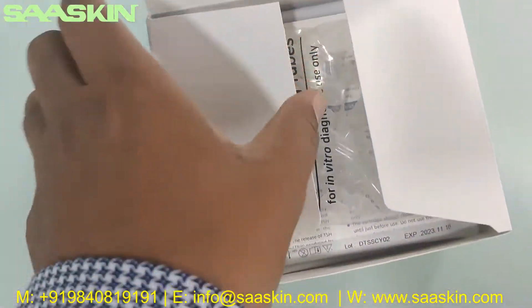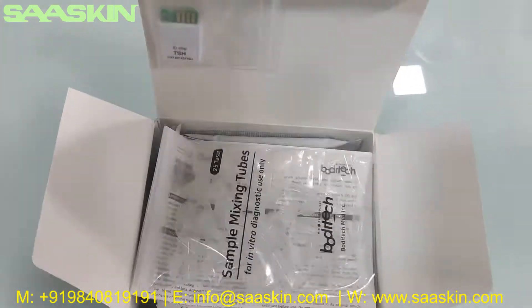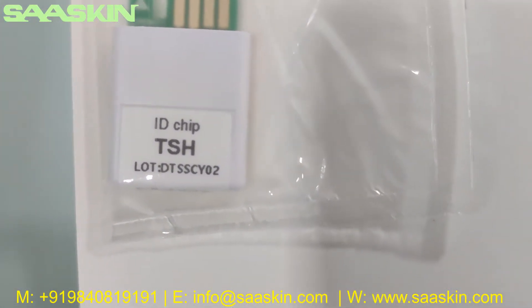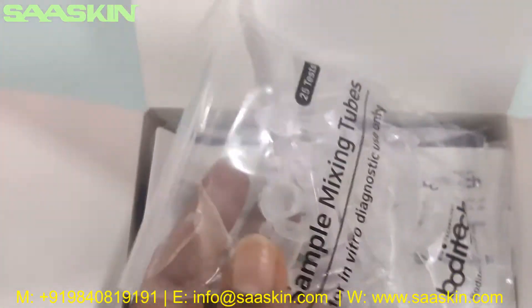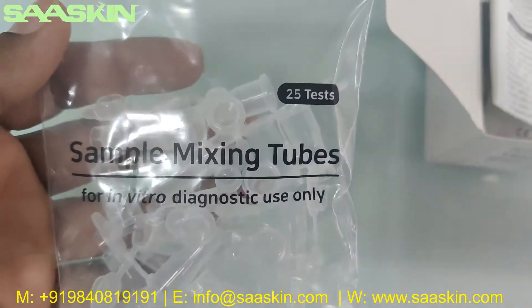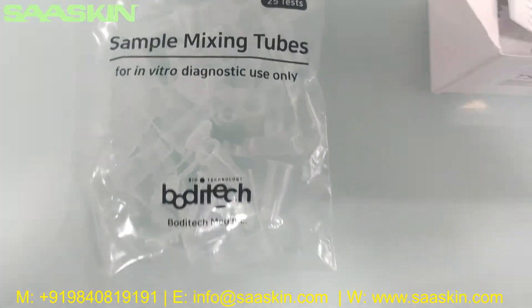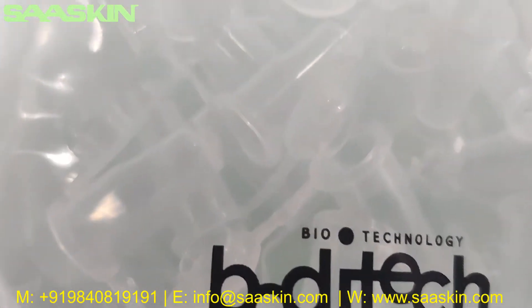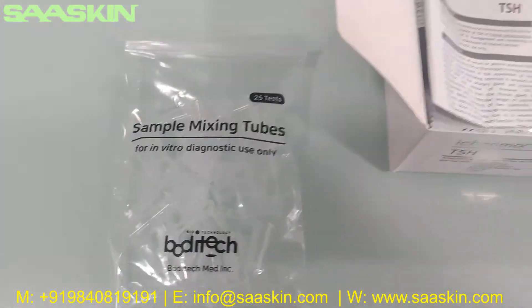Let me open this. Inside the box, you can find one ID chip — it says TSH on it. And going further inside, you can see there are 25 sample mixing tubes. Here they are — this is how the tubes look like. Sample mixing tubes, 25 in total.